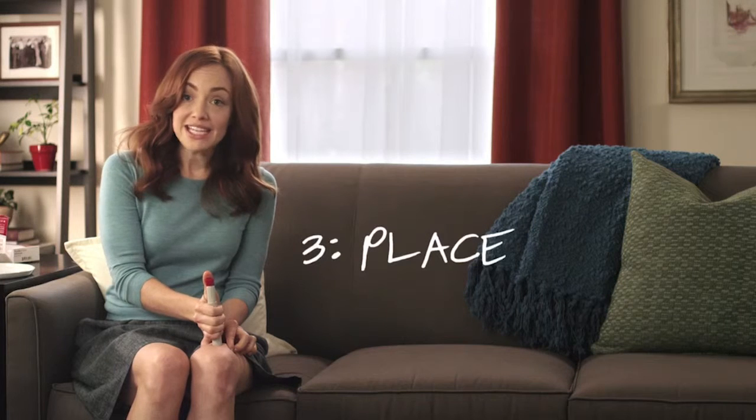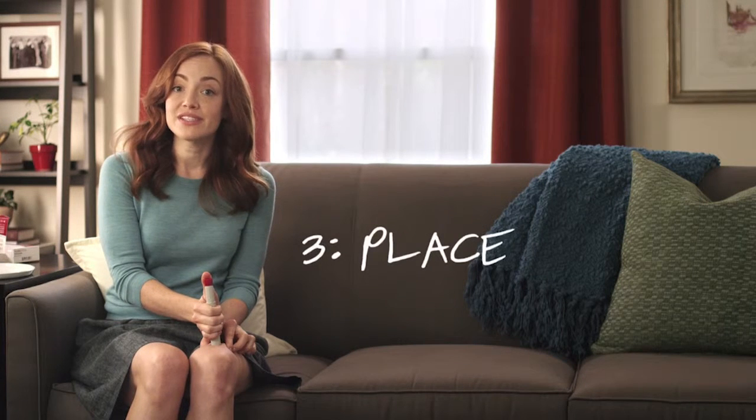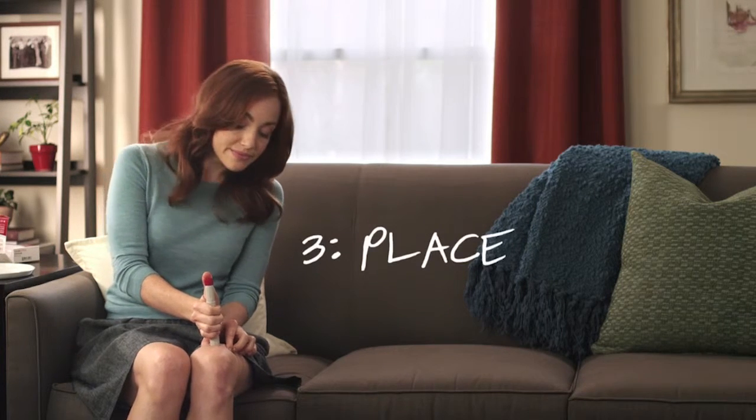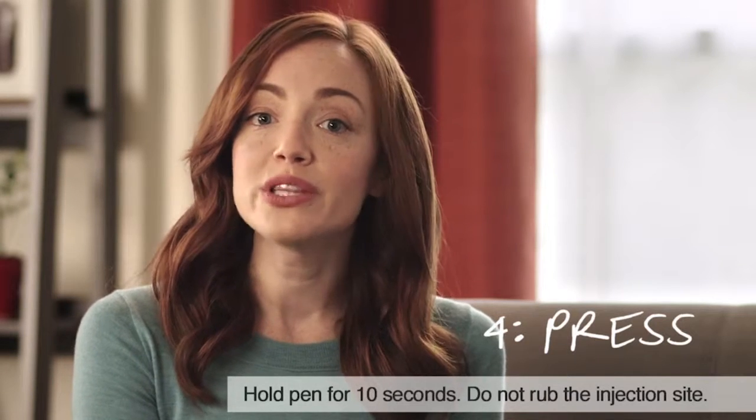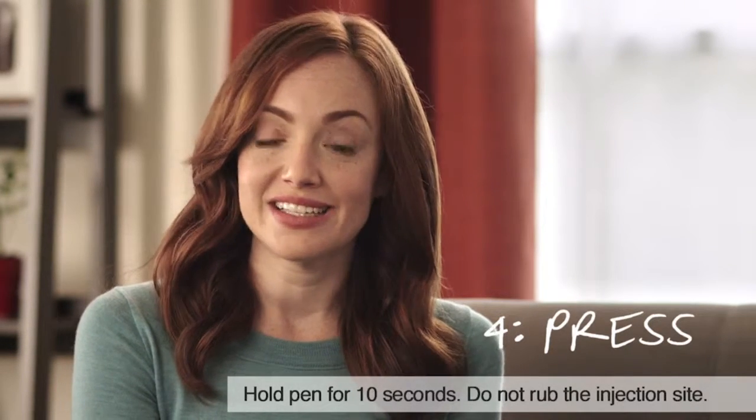Once you squeeze the area of skin that you've just cleaned at the injection site, place the white end of the pen on the raised area of skin at a 90-degree angle. And finally, press the plum-colored button until you hear a loud click and hold the pen firmly in place for 10 seconds. Remember to review the complete patient instructions for use included inside the Humira package before giving yourself an actual injection. I hope this video helps you become more comfortable with this.